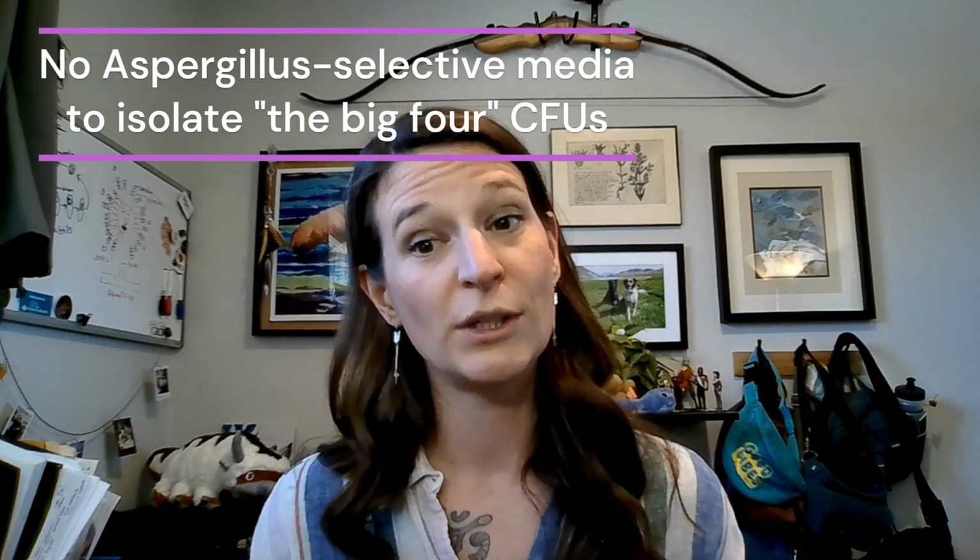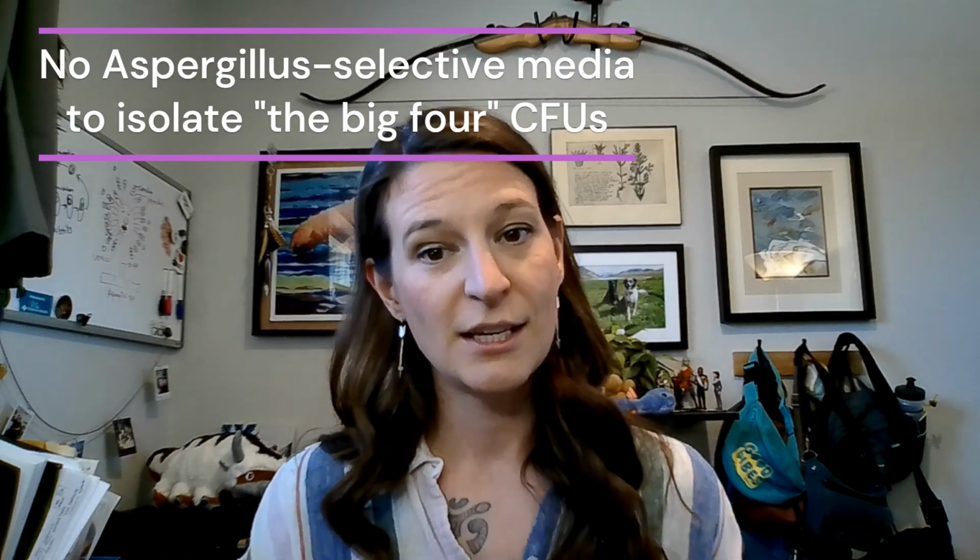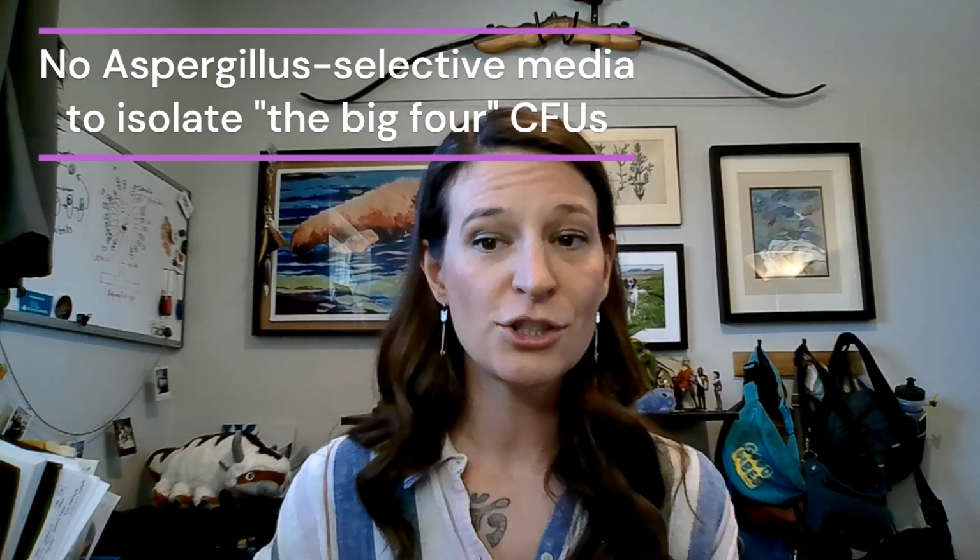There is no selective media that isolates only viable Aspergillus species. So unless you have a trained mycologist who can ID based on morphology, or you do a lot of comparative analysis and send out samples for sequencing, get their morphology lined up with the species that you're finding, and really train yourself, you really can't enumerate CFUs specifically for those 4 Aspergillus species tested for in cannabis.